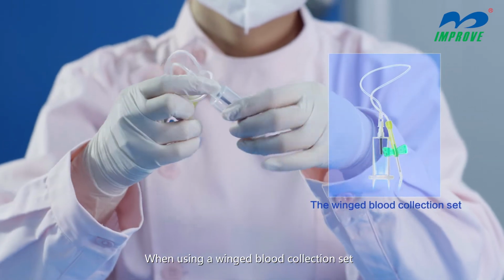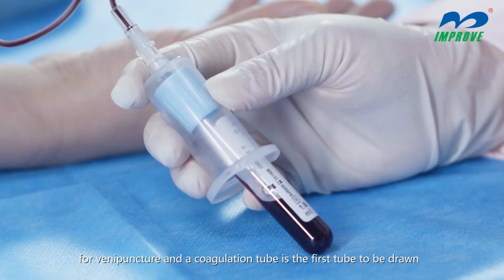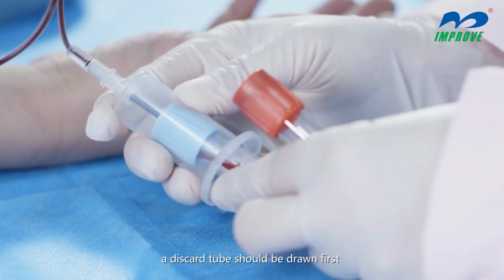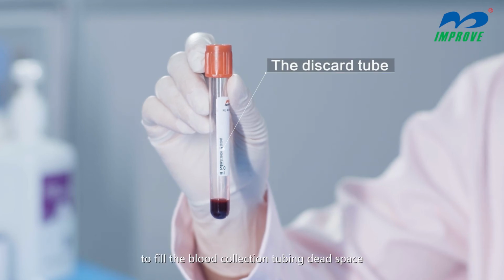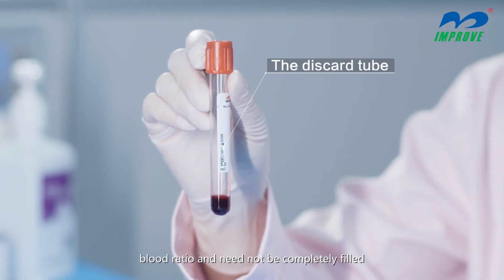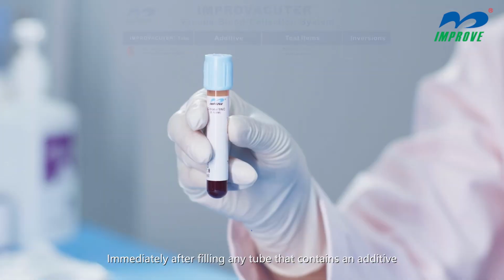When using a winged blood collection set for venipuncture and a coagulation tube is the first tube to be drawn, a discard tube should be drawn first. The discard tube must be used to fill the blood collection tubing dead space and to assure maintenance of the proper anticoagulant to blood ratio, and need not be completely filled. The discard tube should be a non-additive or a coagulation tube.